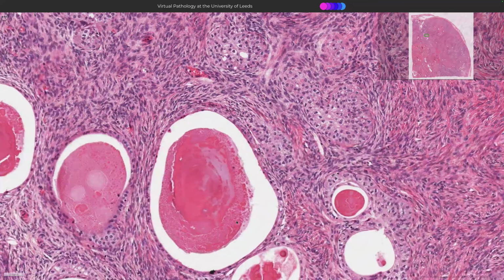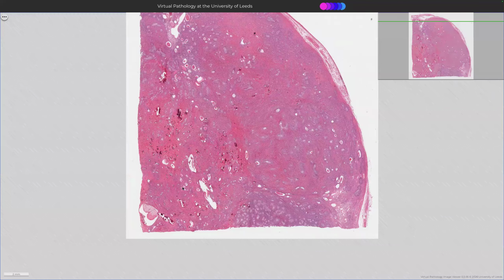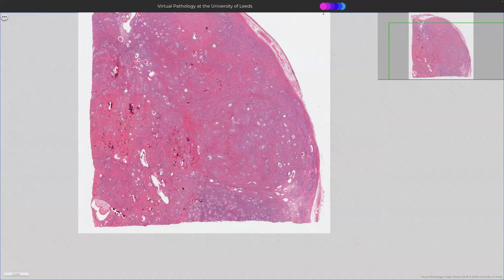Okay, because they secrete mucin into the middle. And some people have suggested that metaplasia in these Brenner tumors leads to the mucinous cystadenomas because they are associated with finding mucinous cystadenoma. It's extremely rare to find a malignant one.